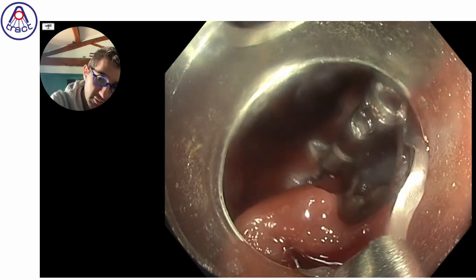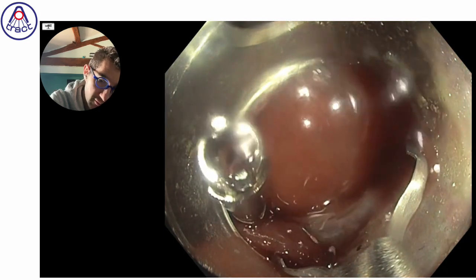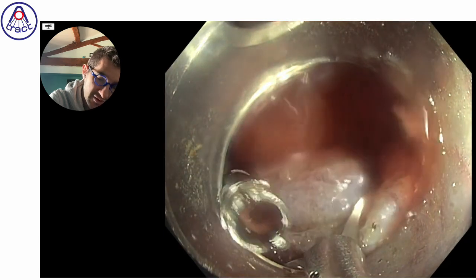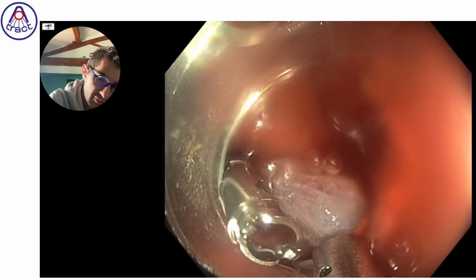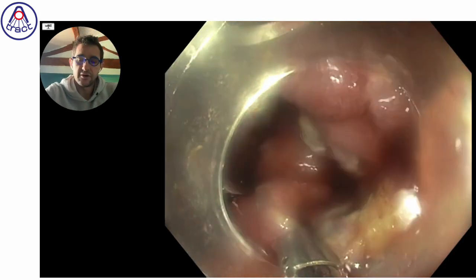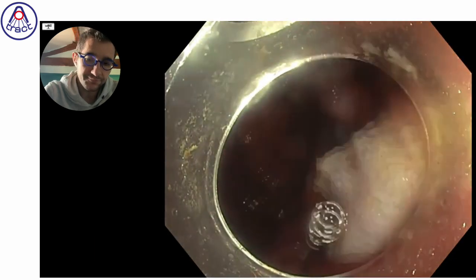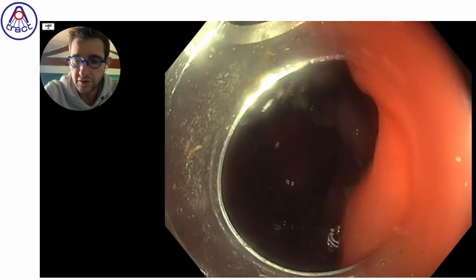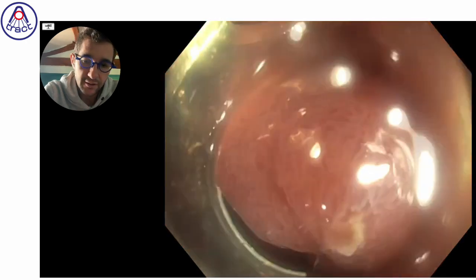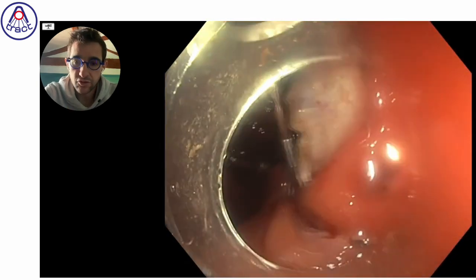So really, even if data are needed to be sure it helps to close, for me, it is still a good way to be more confident about the issue and the adverse events of the procedure. So at least in the right colon, I almost close everything. When it reaches 4 centimeters, for example, I almost close all my ESD cases. But I'm not saying you should do it.